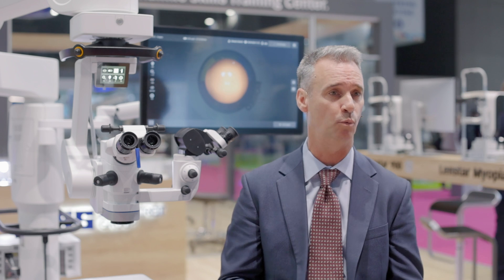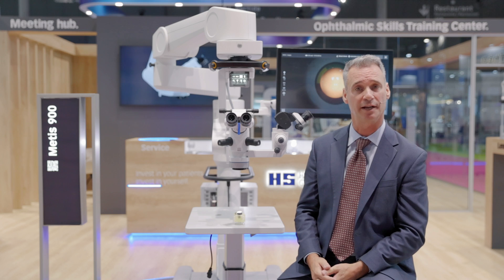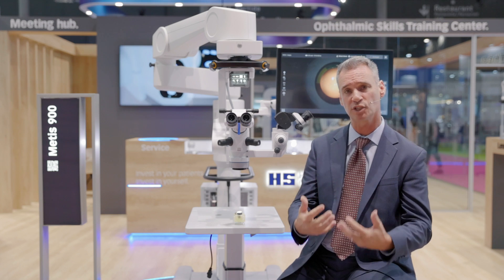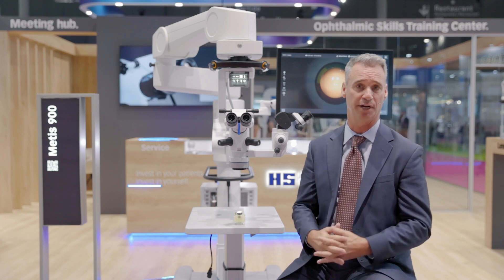So far, the Metis microscope has been very well received. At ESCRS, we've had a lot of surgeons come to see the microscope, and they're really impressed with the innovations that we've incorporated — innovations that make the microscope genuinely beneficial for them in the operating room.